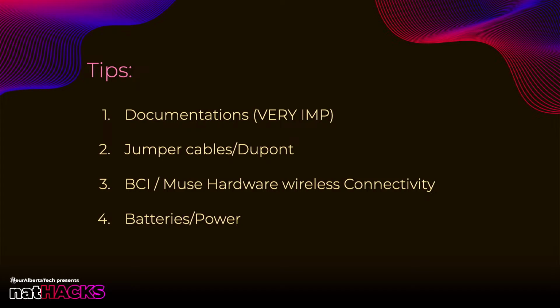Next, let's go to the wireless connectivity part. We give out the BLED112, which is basically a Bluetooth dongle for our BCI hardware. The OpenBCI Ganglion box, the kit, comes with it, as for Muse 2 and Muse S. If you require one, you can ask me at the station and we will give you one. And if you want to use the native Bluetooth from your Muse to your MacBook or your Windows or Linux laptop, you should be using the BLED for more accurate data output.